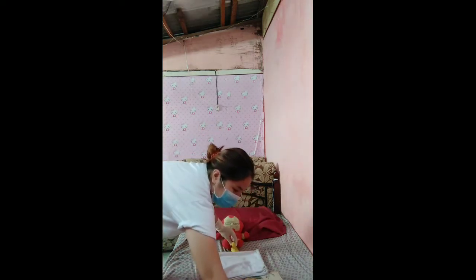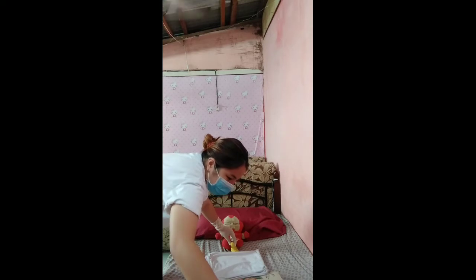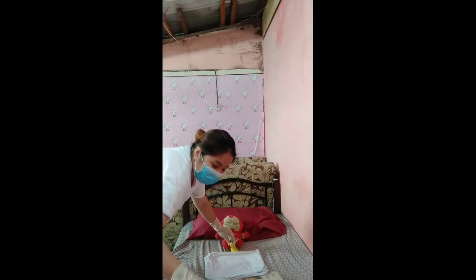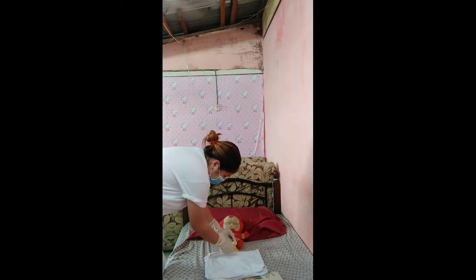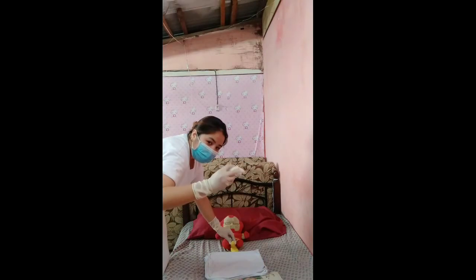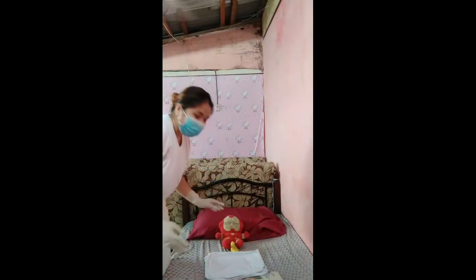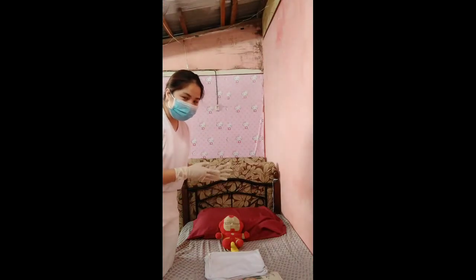Put another alcohol swab, and on the other side, 1 circle only, then discard. And the last alcohol swab, 1 only, then discard. So we are ready to insert the catheter into the urethra because the meatus is clean now.